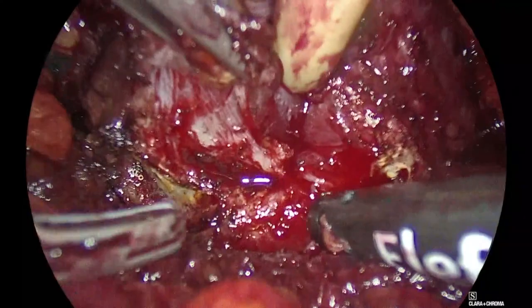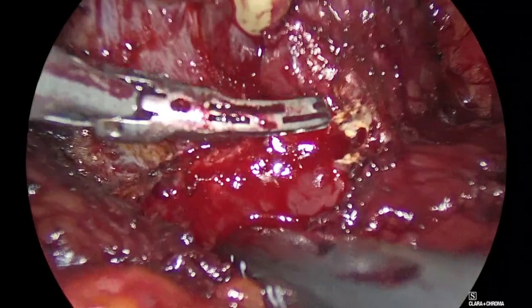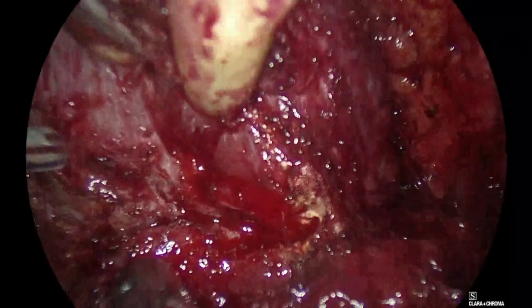Yes. So I will detach the bladder. This is the most tricky part of this operation, the posterior bladder wall. Rotate, Padeli. Rotate to the right. To the right, Padeli. Padeli, come. Okay, show me here. Aspirate.